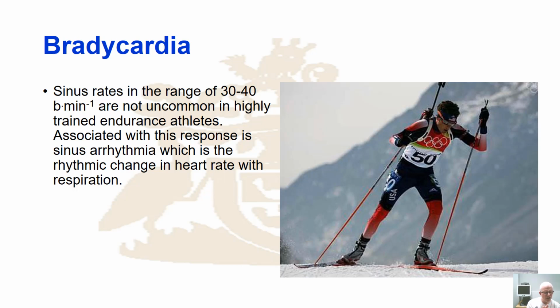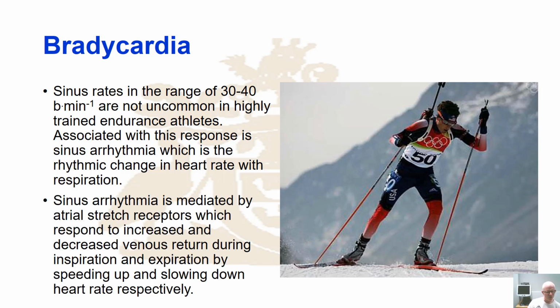And why? Well, it's associated with what's called a sinus arrhythmia, which is a rhythmic change in the heart rate with respiration. So this is fascinating. One of the things to recognise, and what you have to do as a trained individual using ECGs, is be able to distinguish between the actual heart rate and the arrhythmia, which is in essence just the rhythmic change in the heart because of rhythmic change in respiration. You find that a lot of endurance athletes have a heart rate that responds to breathing rate. They tend to have exercise workloads, actually running cadences, for example, which respond to breathing rate and so on and so forth.